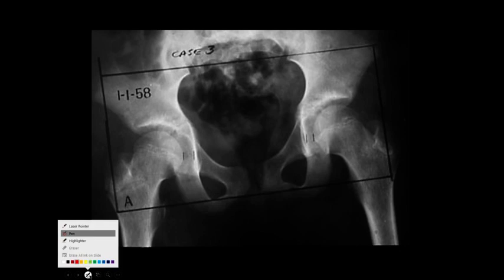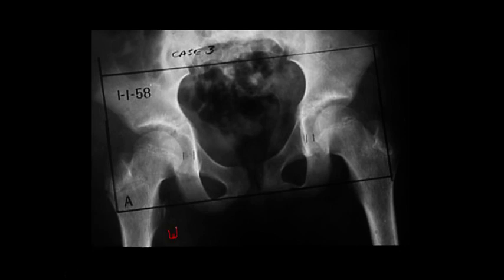Is there a typing thing? There is not. Okay, let's do this. Waldenstrom sign. So Waldenstrom sign, what it is, in an immature hip, Waldenstrom, in an immature hip, greater than 2, and it's got the umlaut, greater than 11 millimeters absolute value or 2 millimeters difference side to side.